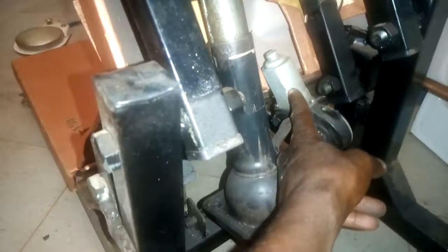So in making the movements, I had to make an actuator. I used the car window motor. When you look at this motor, if you are conversant with your cars, you'll see this is a car window motor. So I attached the window motor to this spindle, and the wires here come up that side. This one specifically is to do the up and down movement.